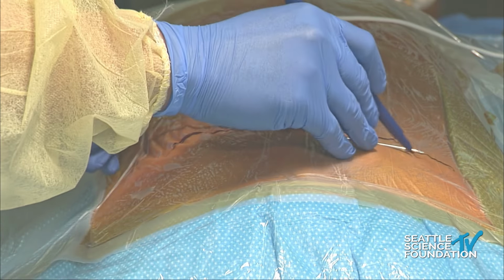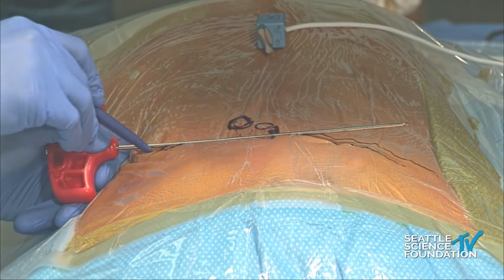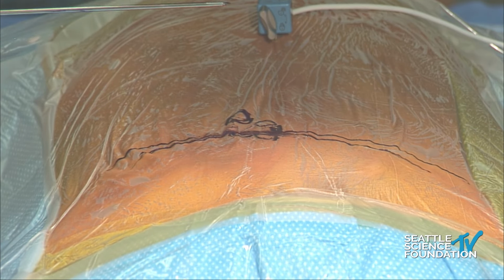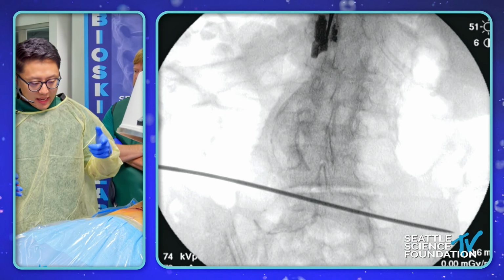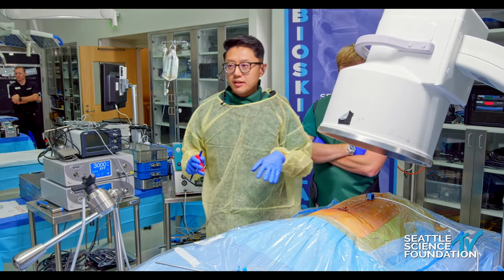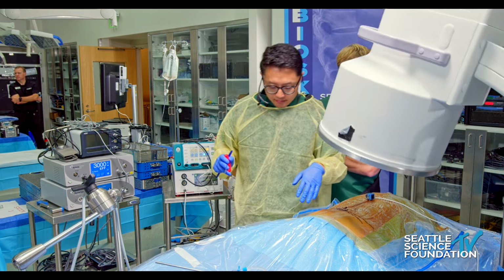And so I'm going to draw my AP trajectory line here. This is going to give me a visual clue and guide me towards the spine once we actually do the approach. So at this point, what I typically do is I go to the lateral, and now we're talking about that spinous process line.